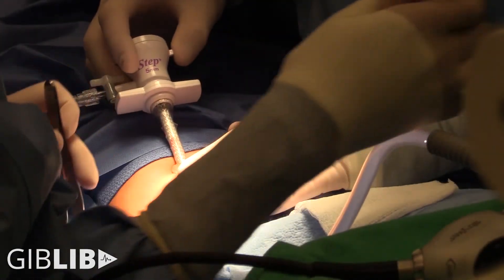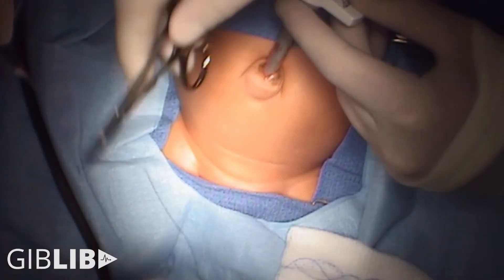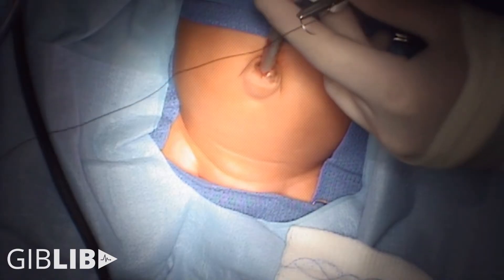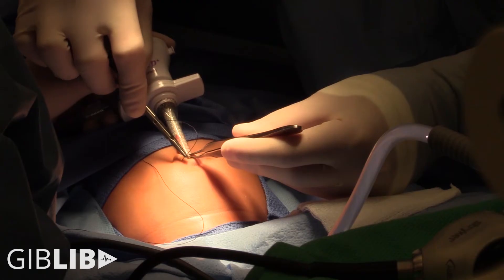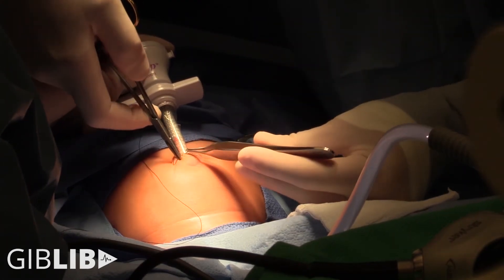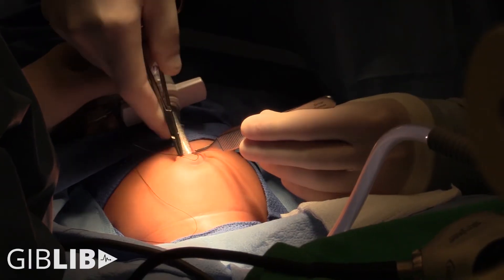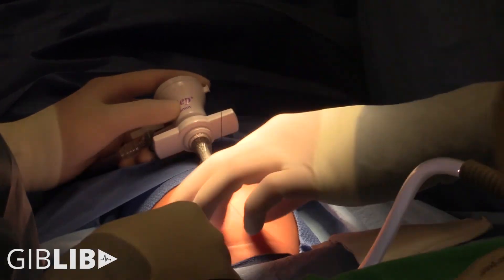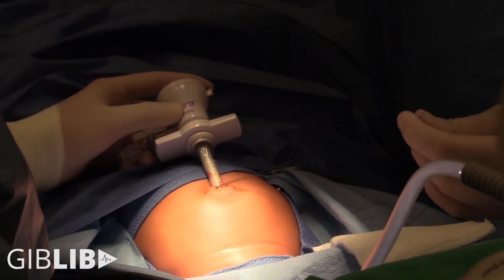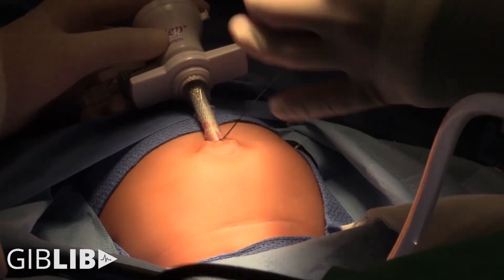So I'm going to show you how I do it. Hold this in place for a sec. To kind of tighten it up, I grab each side of the skin and actually get a little bit of the port sheath itself, which sometimes causes the air to leak but usually it's okay. Then scissors — just cut the needle off. Tie that down to make it airtight.